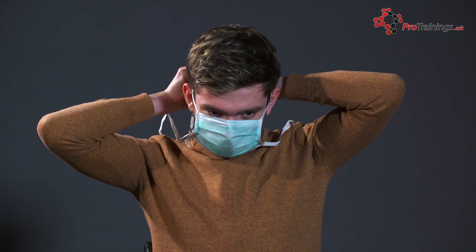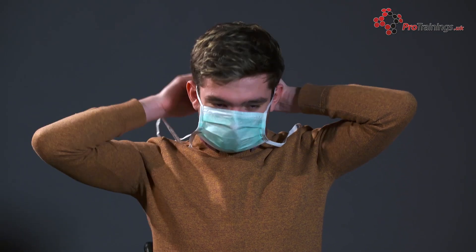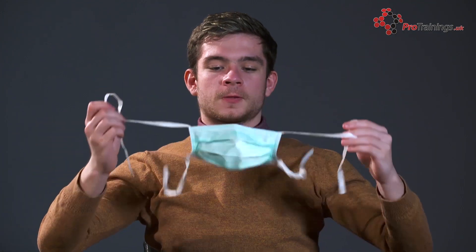If there is a tie, untie the bottom one first, then the top, and hold the top band to remove it from your face. The mask should be disposed of correctly, and then you should wash your hands straight away.